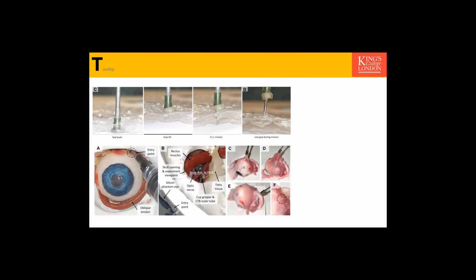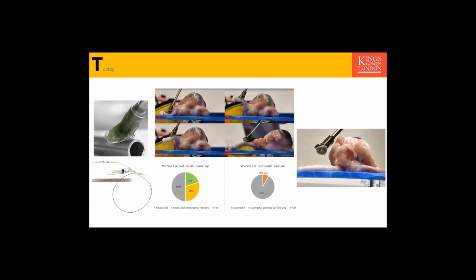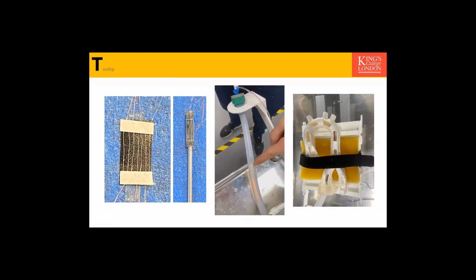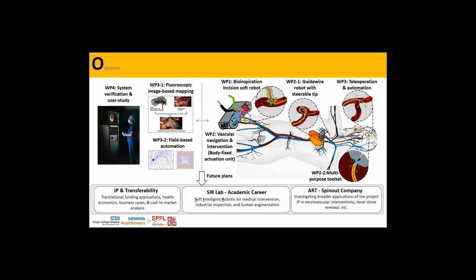Yes. So we did an accessibility test. We did some tests on grasping actual tissues. We couldn't perform incision on the actual tissue. Then we designed a curved, inclined cup, did some tricks, and we could achieve 100% incision this time after the redesign of the cup. Also, we're working on miniature force sensors to deploy at the tip of the system. You can see them in our in vitro test with realistic electrical properties, similar to blood inside our body.